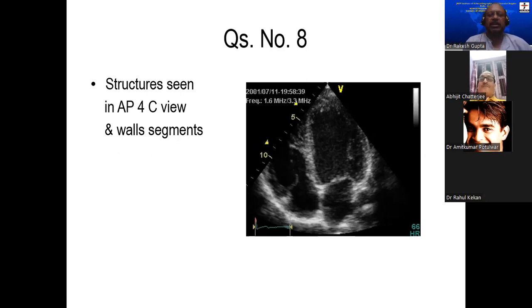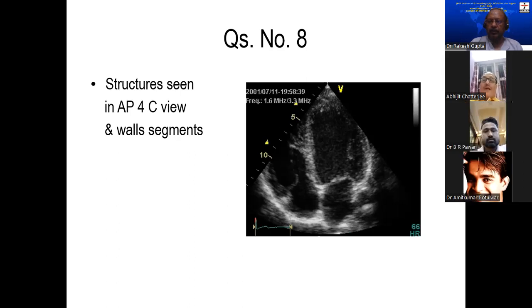Apex, okay, is fine. If you are keeping the probe at apex, index marker at 3, 9 or 11 o'clock position? Which position? 9 o'clock position. It should be 3 o'clock position, man. Okay. Index marker at 3 o'clock position, and then you make this particular view.